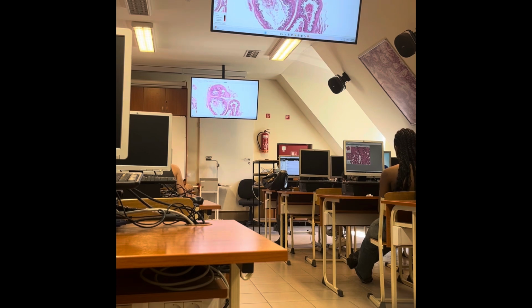And now I will continue with the prostate gland. That is not a very complicated specimen, yes?